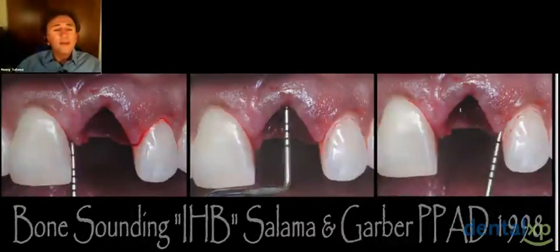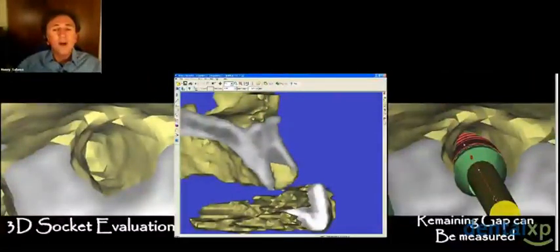And what you see here is that after extraction, we go back and make sure that our initial diagnosis is actually accurate. So we'll go and bone sound again to the interproximal, look at the labial plate, check that there's no perforation of the osteotomy. And only then do we start to check and verify that what we've done virtually through our digital diagnosis is the same as what we find clinically.